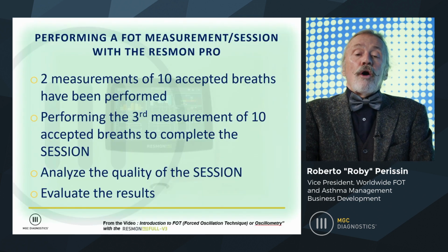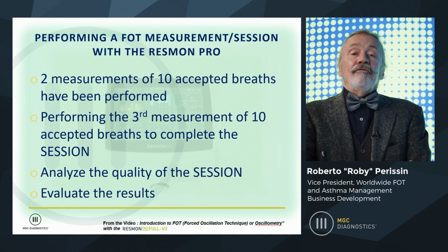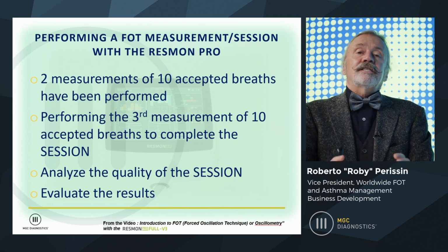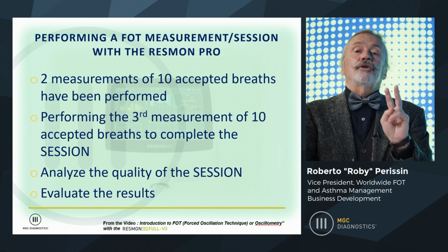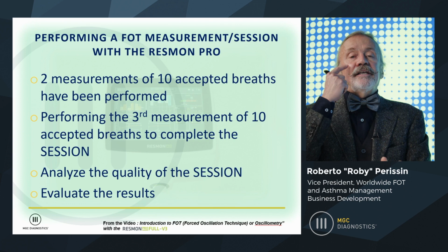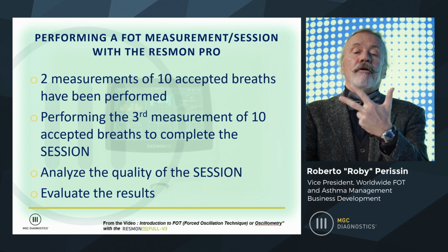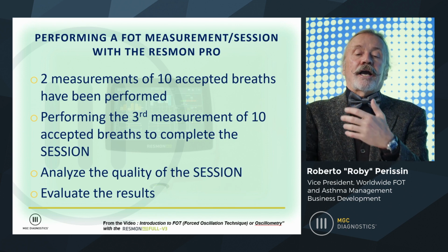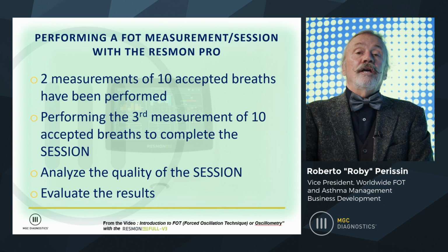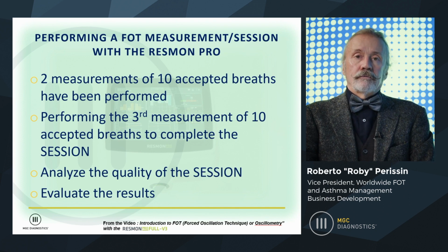To close now, we're going to perform live a FOT measurement with the Resmon Pro Full. Notice that we already have performed 2 measurements. So now we are facing a session. We're going to perform a third one. We are going to check that the results are repeatable. We're going to analyze the quality of the session, and we're going to evaluate the result.